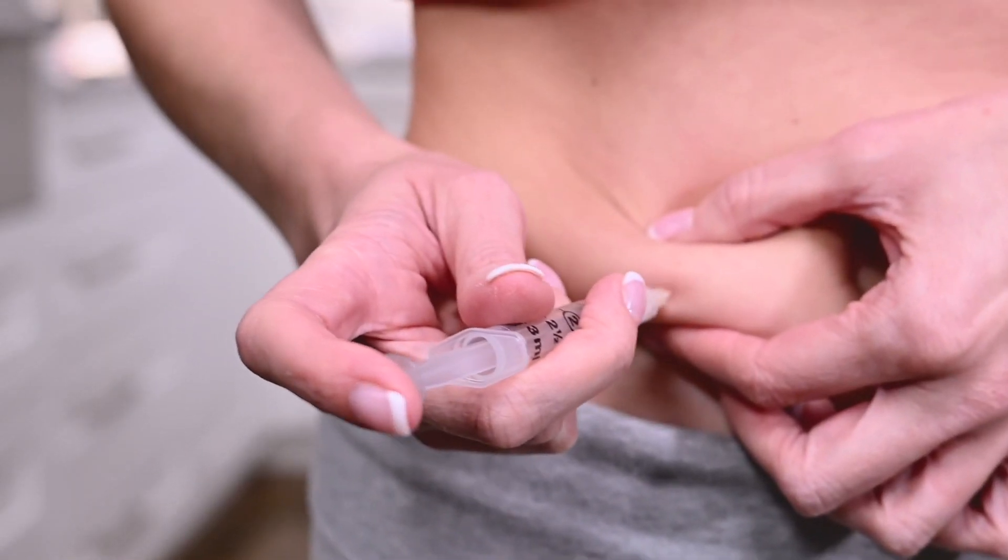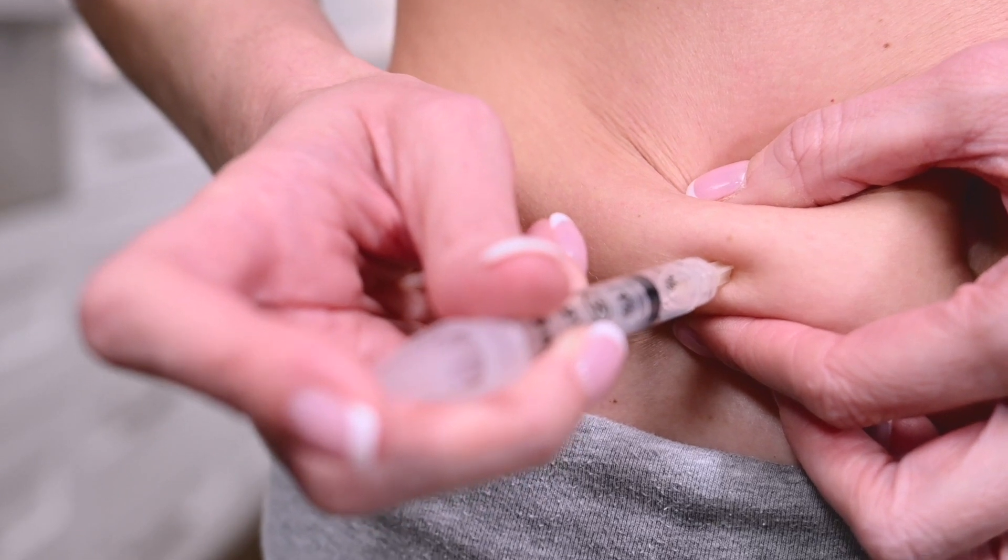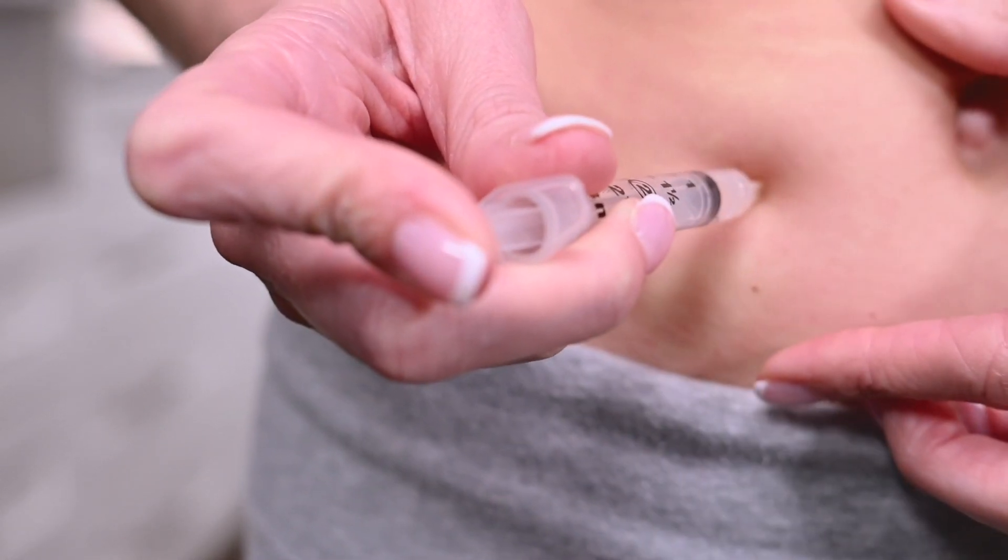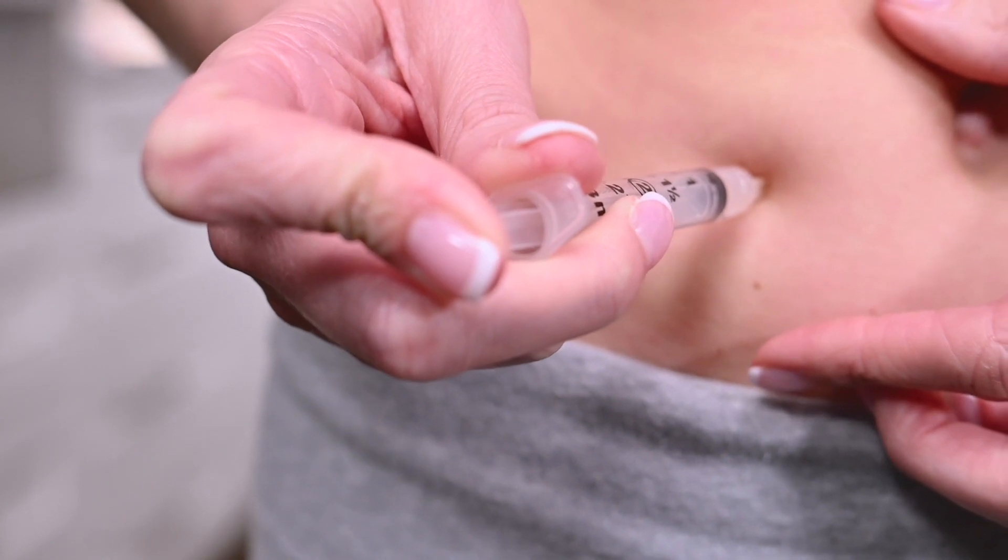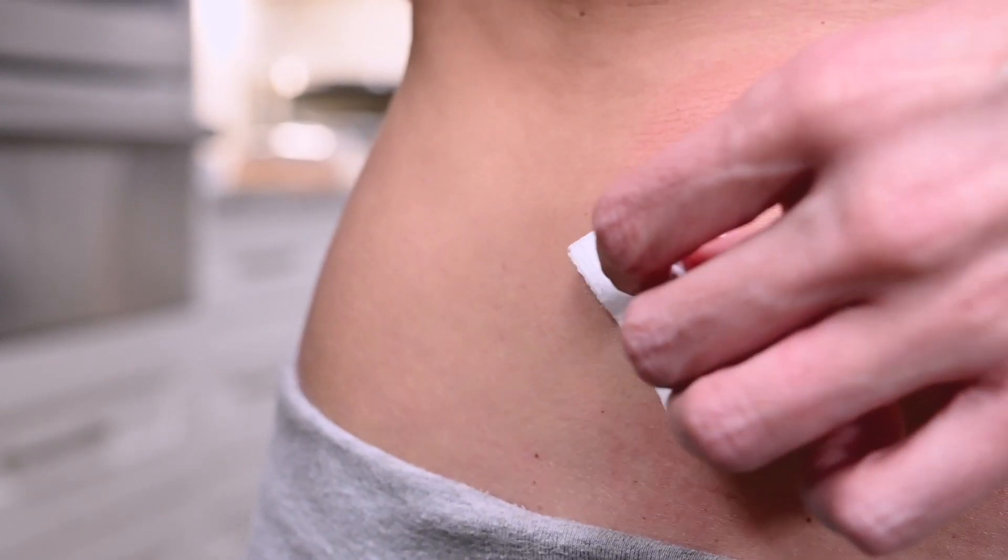Take the syringe in your preferred hand. Pinch a fold of skin between your fingers and insert the needle at a slight angle. Release the skin after the full length of the needle is inserted. Push the plunger until all the medication is administered into the injection site. Gently remove the syringe and apply pressure with gauze.